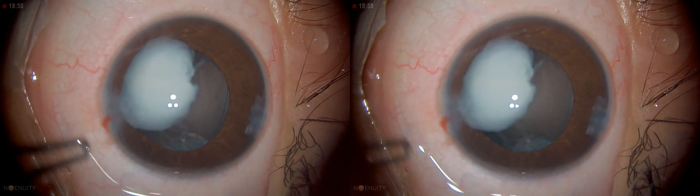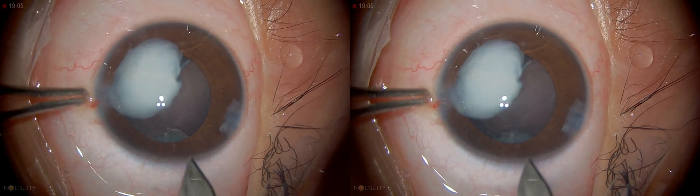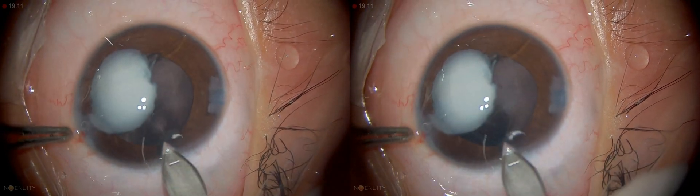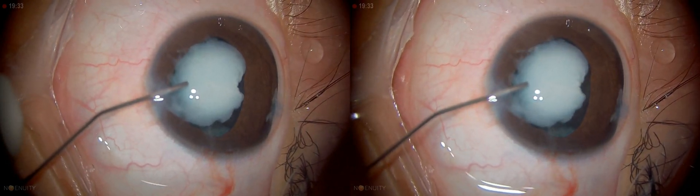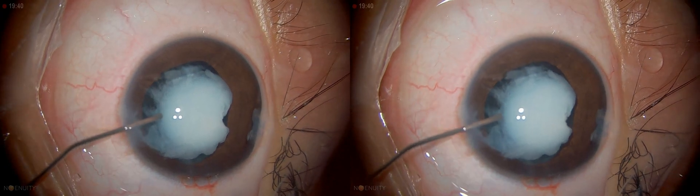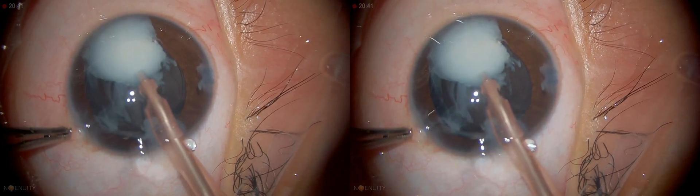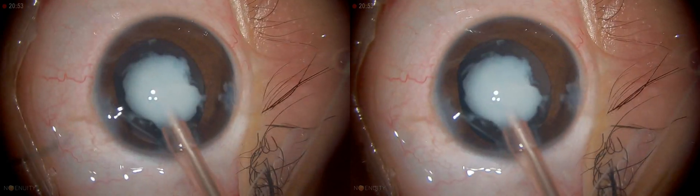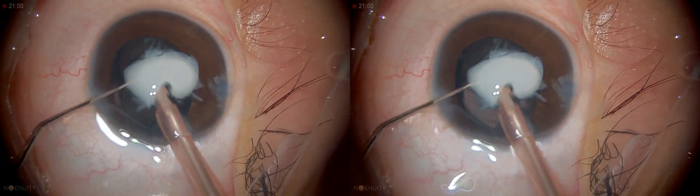Can I have the keratome, please? What is different here is you need to make the main port incision. Generally I don't do this step, but I still do the PPC again as two steps. These are all things you don't expect at the beginning — there's no way I could have said that this is a firm nucleus which is not breaking with the bimanual. We don't have to chop this, so I will use a little bit of phaco energy. I need the second instrument because this nucleus floats so much — this is unexpected.